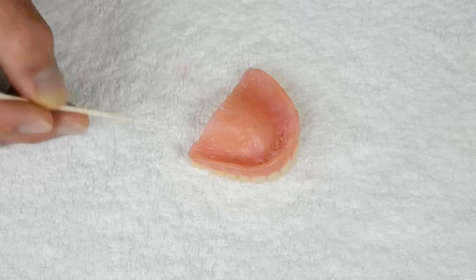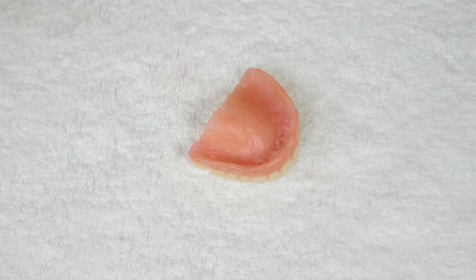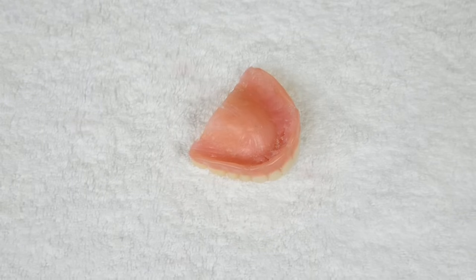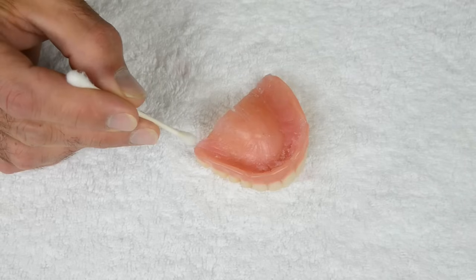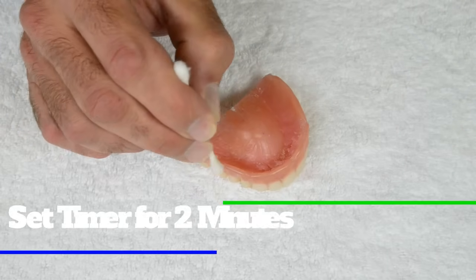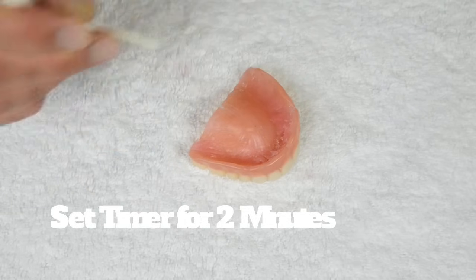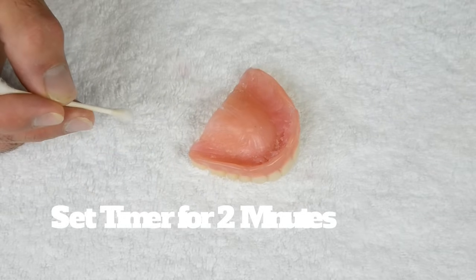Do not cover existing Denture Fit silicone with primer. If you are applying over a soft liner from your dentist, prime over the soft liner just to make sure it sticks. Apply to the ridge, wall, trough, and one quarter of the way up the palate. Let the primer dry for two minutes.